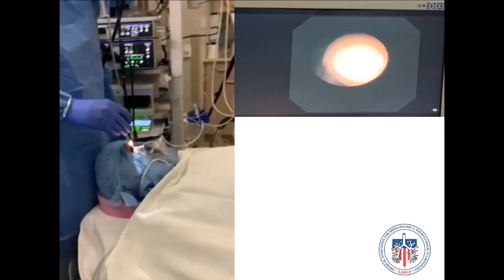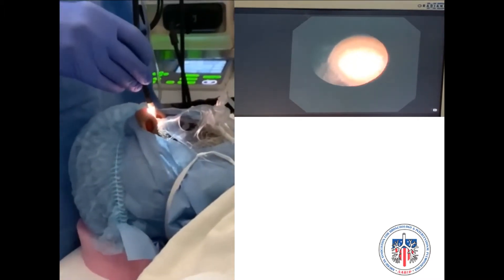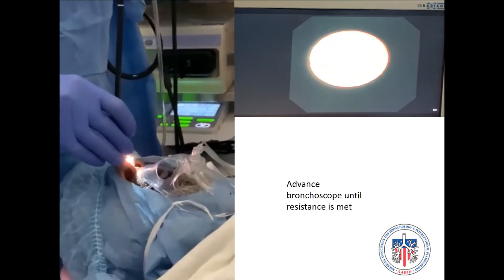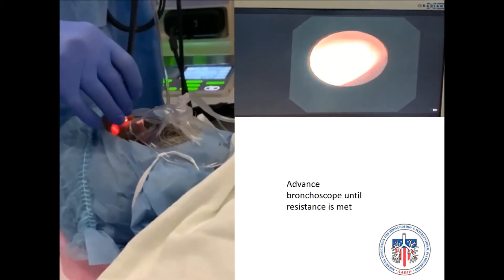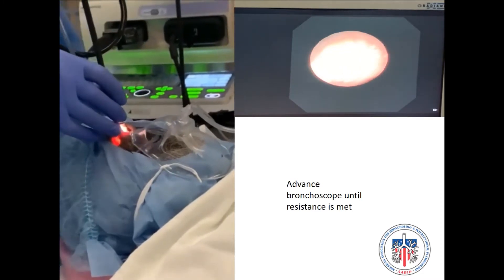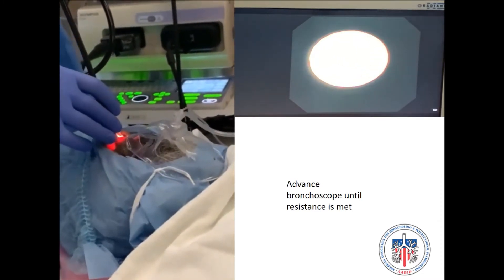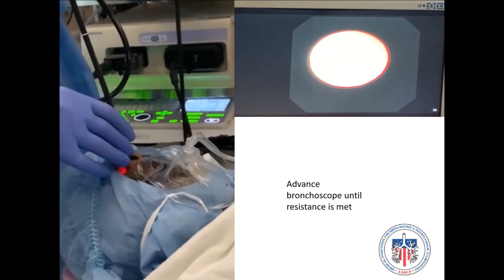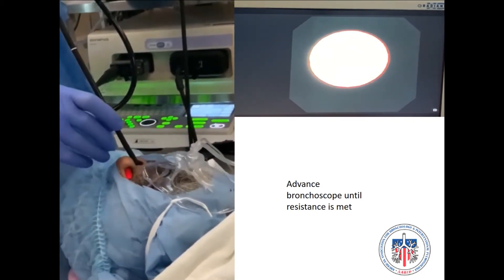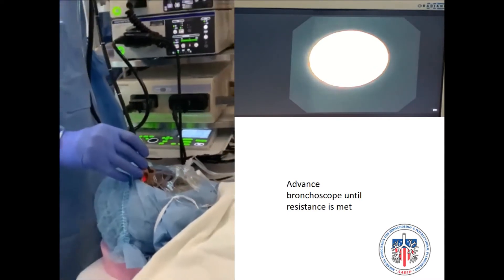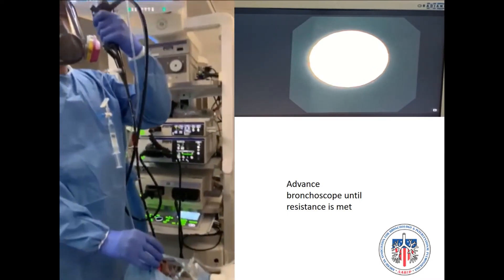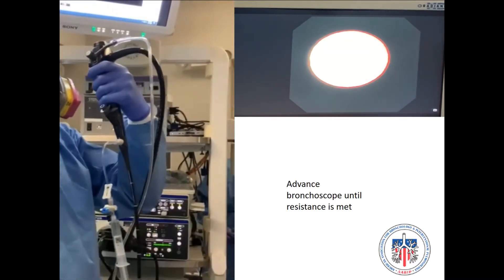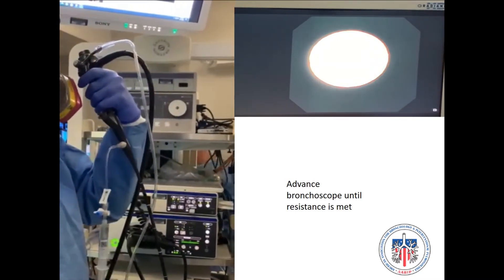Once the scope is in position, we will proceed to advance it gently through the nose in between the turbinate passages. During this part, there will be no visualization since the camera is facing the nasal septum. We will advance the bronchoscope until resistance is met. The presence of resistance means that the tip of the scope has reached the posterior wall of the nasal airway, for which we shall not advance the scope any further in order to prevent trauma.